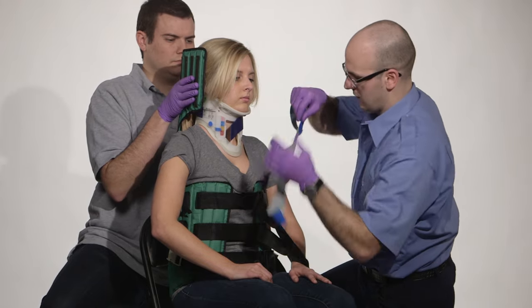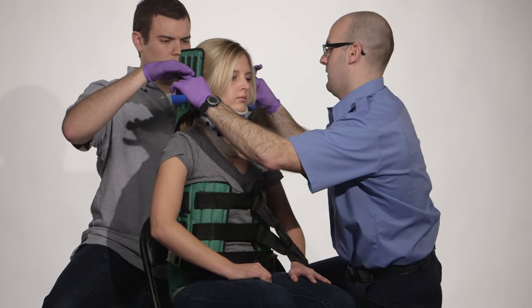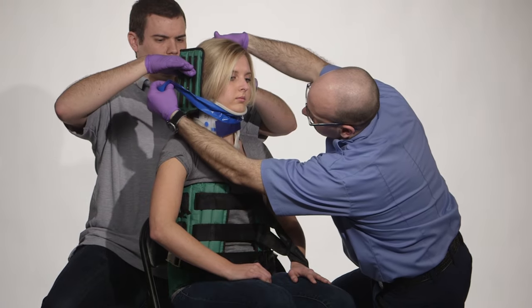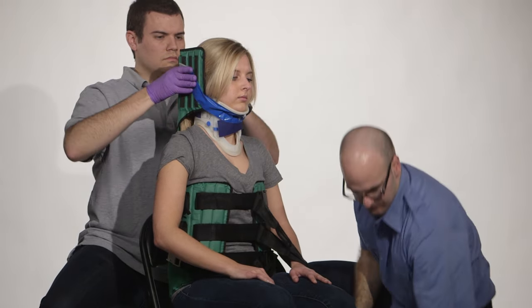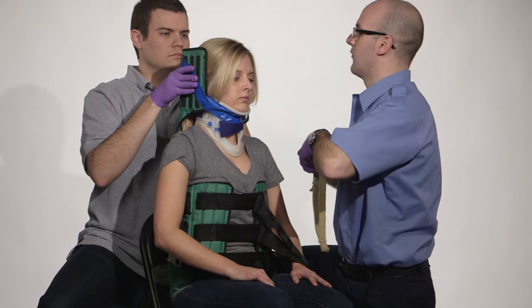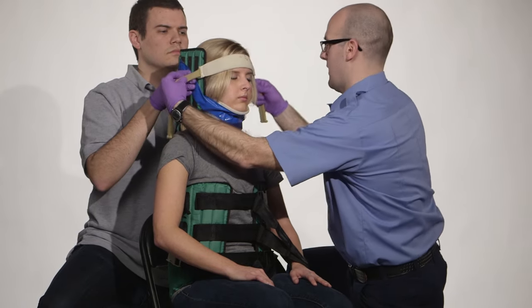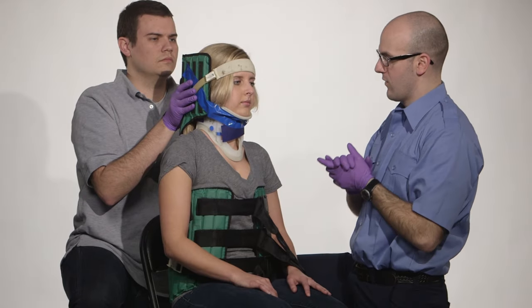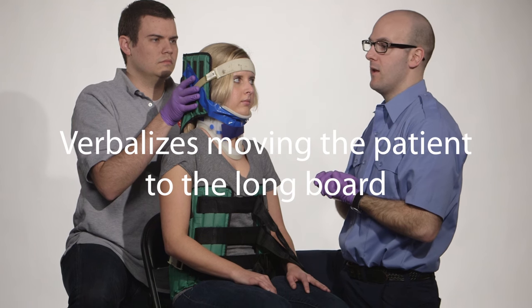First we'll go underneath. I would pad behind the head as appropriate — there is no padding necessary. The head is secured. Now we would transition the patient onto a long backboard and secure her to that.